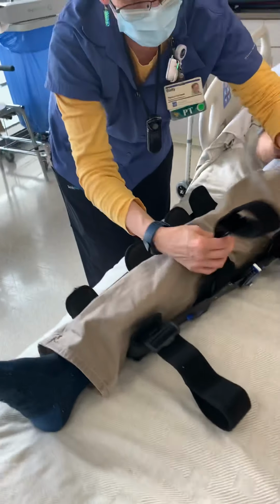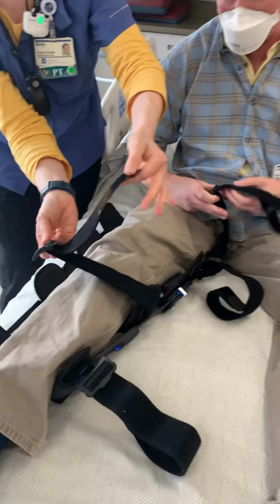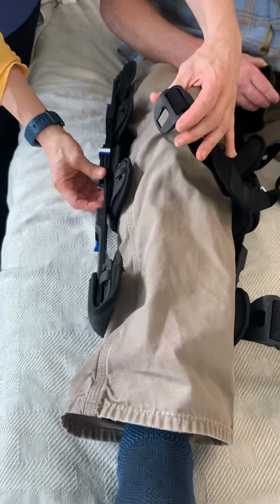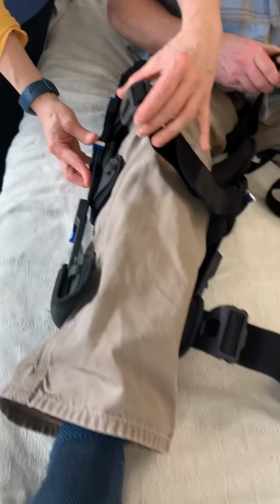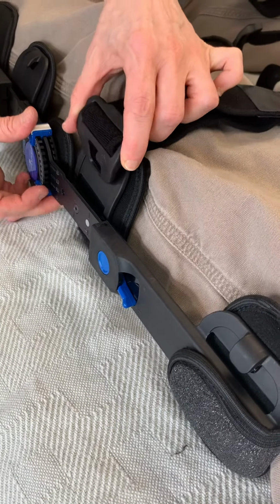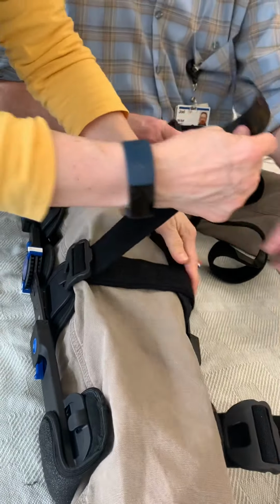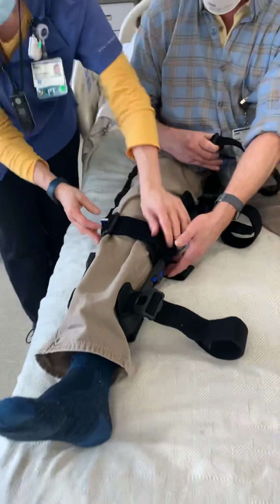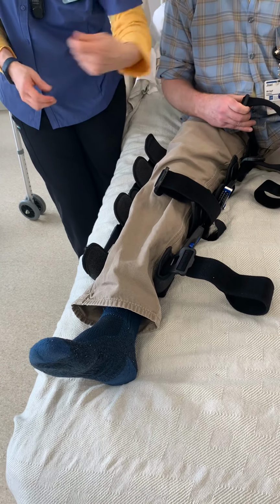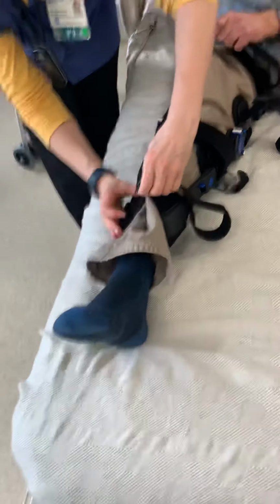And then these have these kind of cool little connectors here. I don't know if you guys can see the connectors very well. So it's got this nifty little setup where you got this hole. You may want to come a little closer just so you can see, because it's black on black. It's hard to see. So you got these little nifty connectors here that you'll do around this hook. So you kind of do like that, and it kind of clicks back. And then you tighten it. Once you get the tightness that you want, if you have to take it off again, this is all you got to do. So you don't have to mess with the length again. Nice. Once you get it right. Okay. So then you just kind of go through and hook all these up.